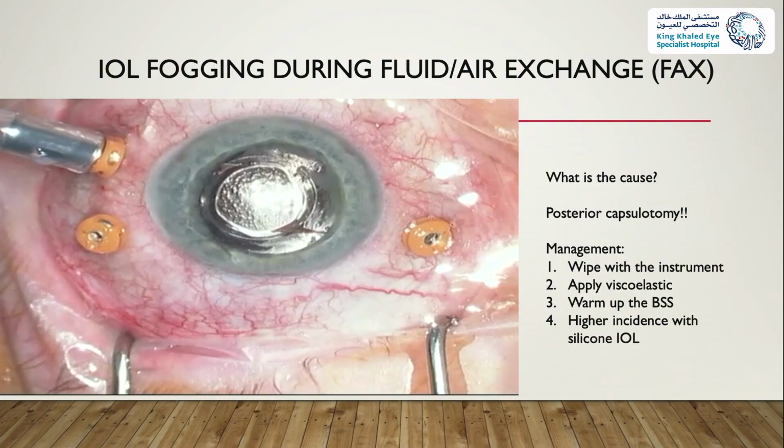then this doesn't happen. So if the capsule is clear or just minimally opacified, leave it alone, because if you do the air fluid exchange, this will happen. And it's also due to the temperature differences in the body and the outside. So the fluid will create a little bit of humidity that settles onto the surface as you start creating a separate air and fluid interface.